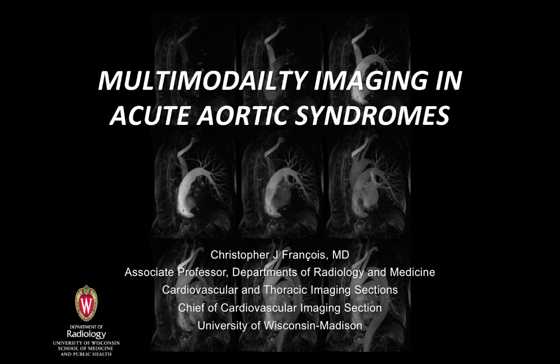Thank you. Today I will be talking about multimodality imaging in acute aortic syndromes.